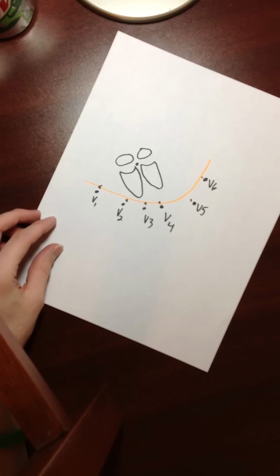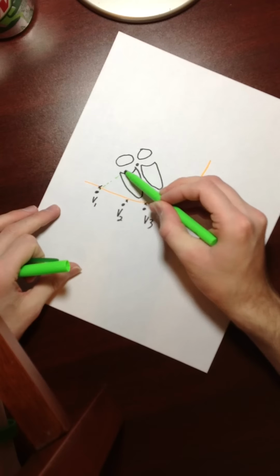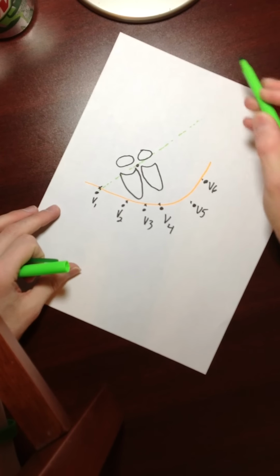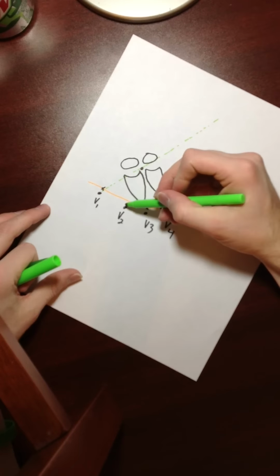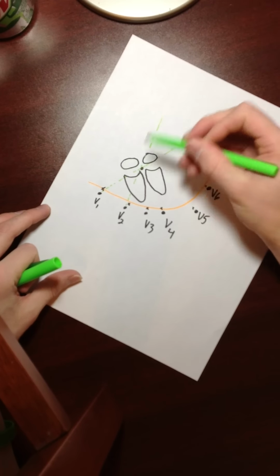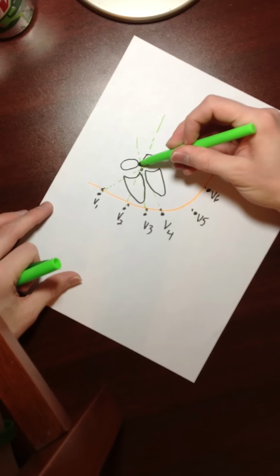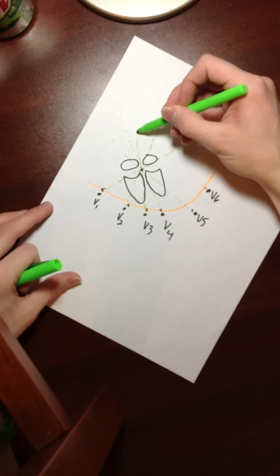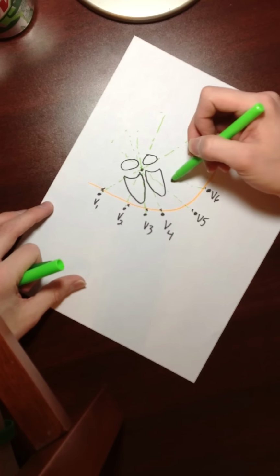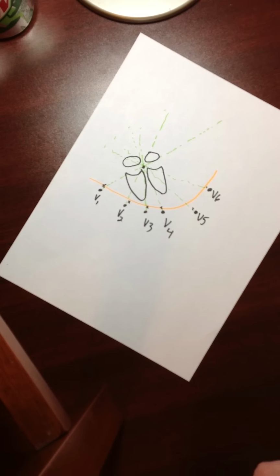And what we do is we take these and go through the AV node. And then somewhere on the opposite side of the AV node is where your negative lead would be. So I'm going to kind of do the same thing here. V3, same thing. And hopefully you get the point by now. And these are all negative over here. Okay. Now what this allows us to do is we get to actually view the heart from basically different angles.